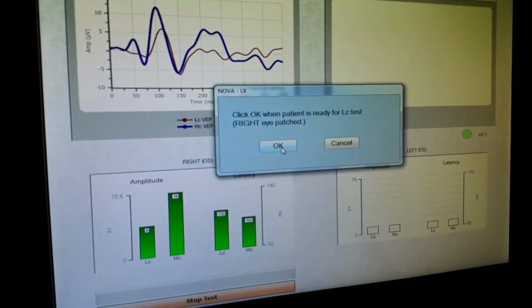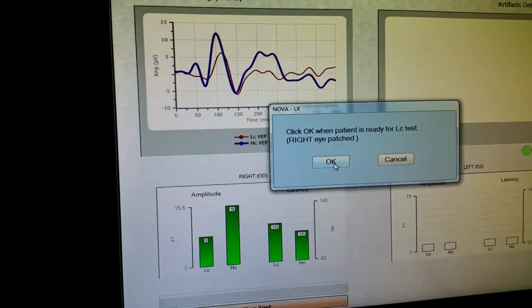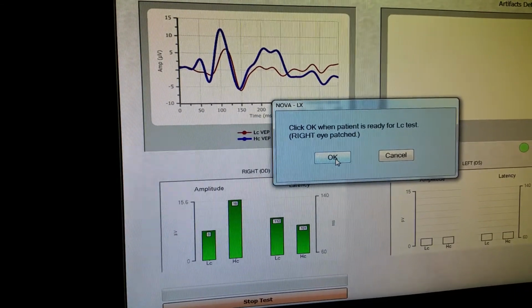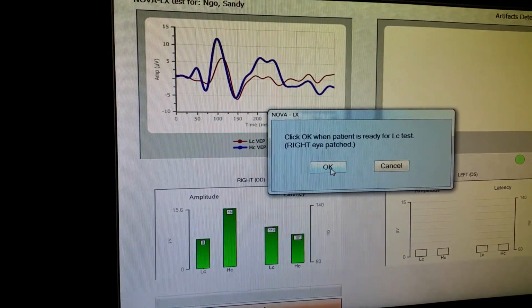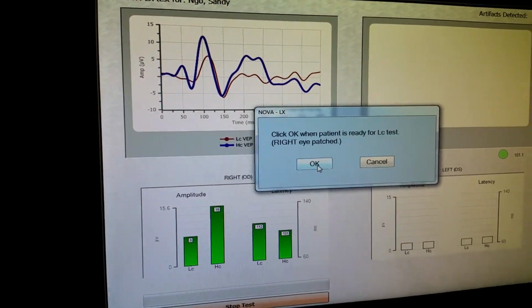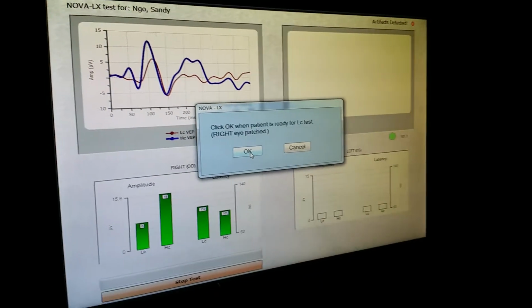Could you see that okay? I always ask them after the demo if they could see that okay, just because whenever you put them in those trial frames and trial lenses, if you don't get that axis right or it happens to slip on you whenever you're putting it on the patient, it's going to make them blurry. So that way, whenever you ask them, could you see that okay? If they say, well, it was really kind of blurry, you can go back and you can adjust the trial frames if you need to, okay?